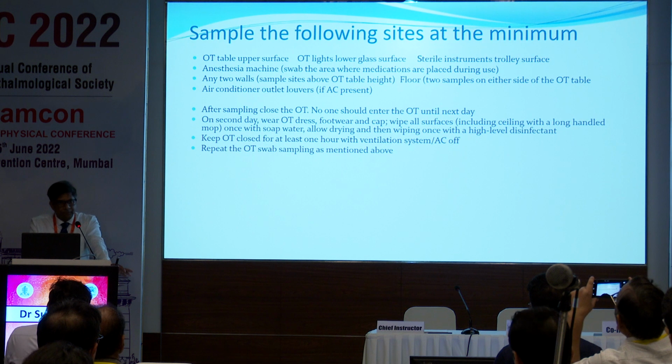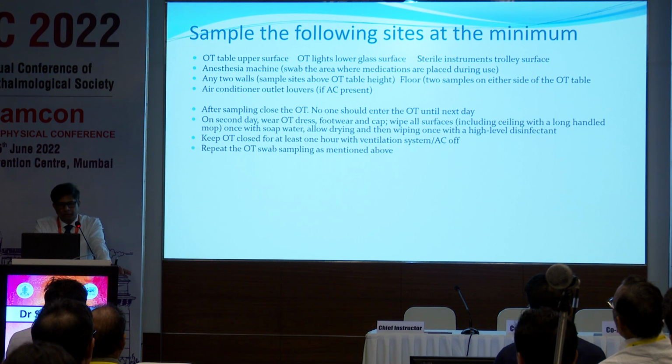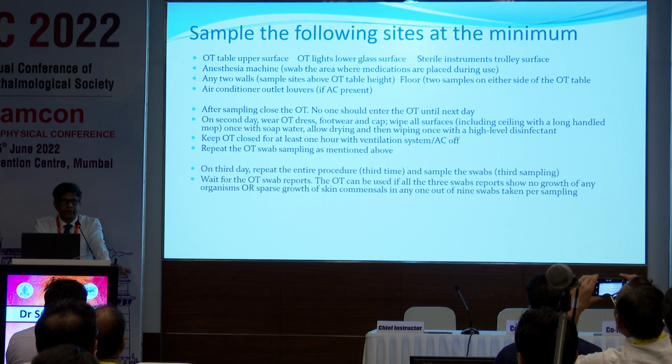After the OT sampling is done, on the second day you have to clean the OT. You have to close the OT until the next day, and the next day repeat the same procedure again and take swabs again. And again on the third day, repeat the same procedure. This is for a new OT.